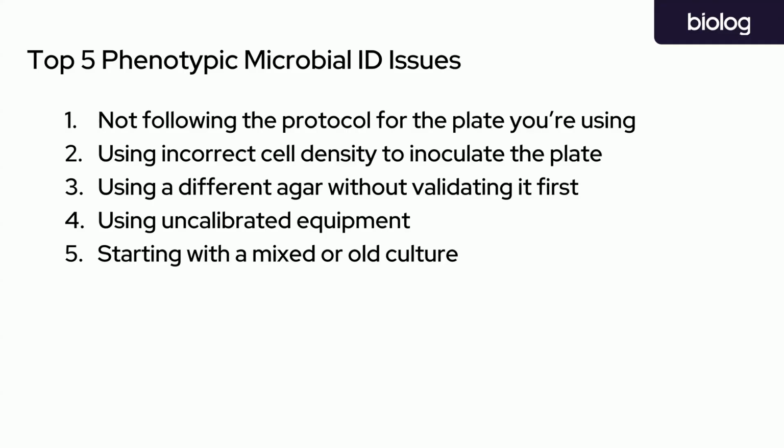Thanks, Dina. So first off, I wanted to just mention these top 5 issues that we see a lot with microbial ID. I'm not going to go into too much depth right this second, but I will be talking more about each of these as I go through my part of the talk. So one of them is not following the instructions for use for the various plates that you're using.